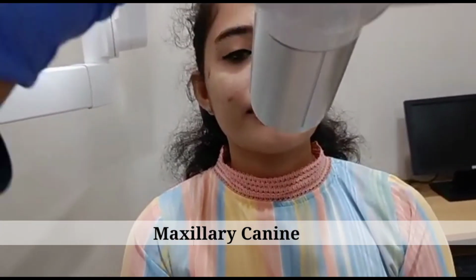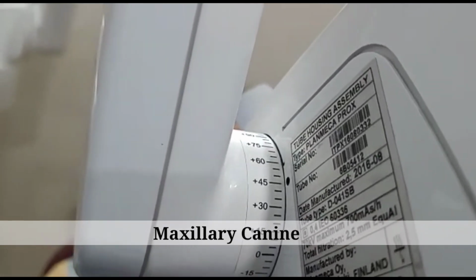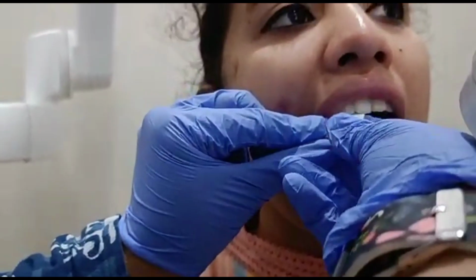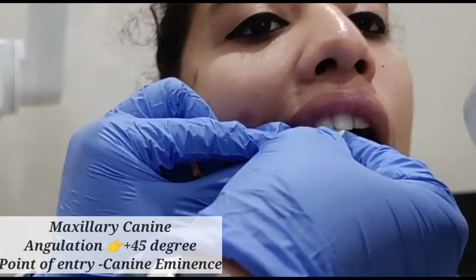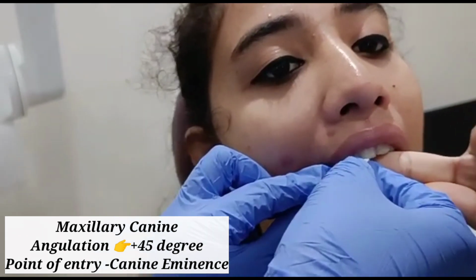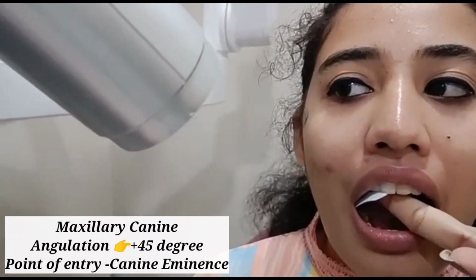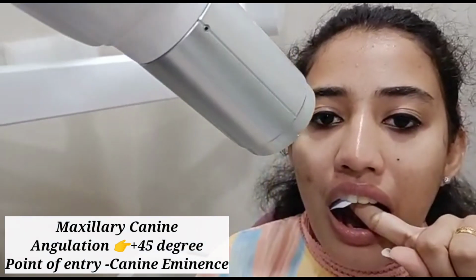Next we move on to the maxillary canine projection. So we are giving a vertical angulation of plus 45 degrees, and we are placing the film in such a way that the center of the film is where your canine must be seen. We are centering the position of the canine in such a way that the long axis of the film packet is parallel to the long axis of the canine.